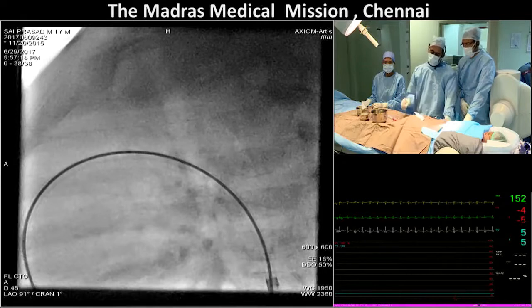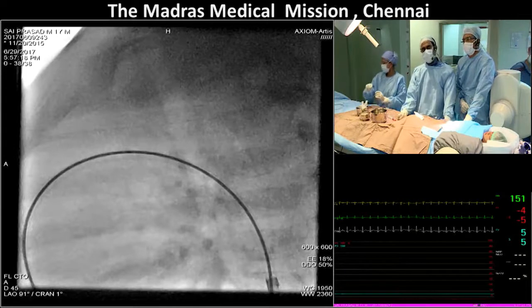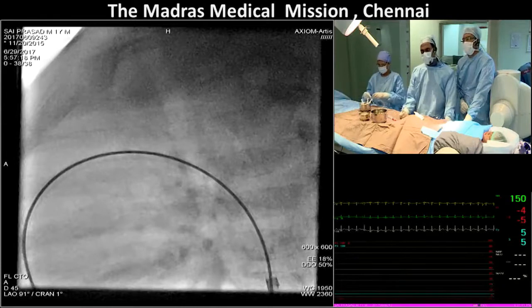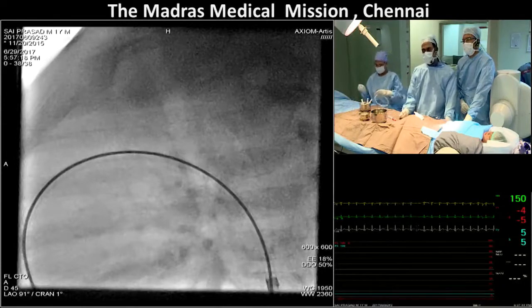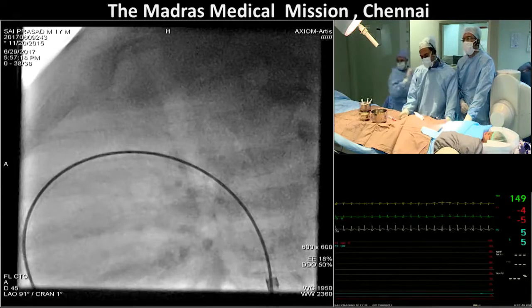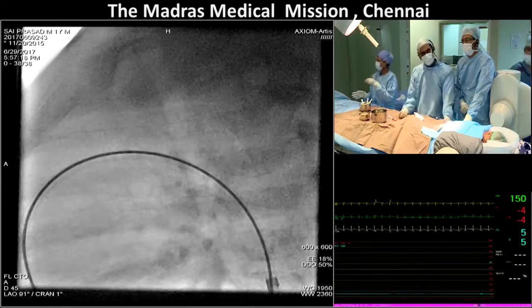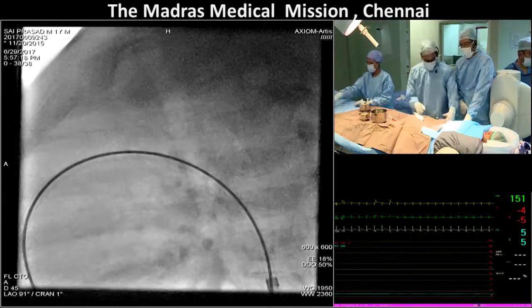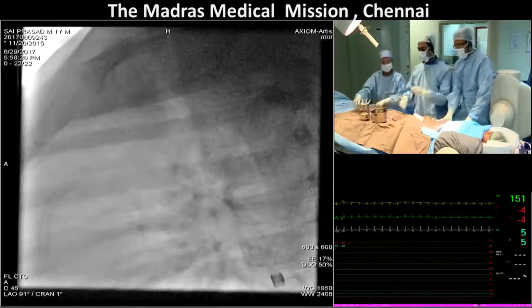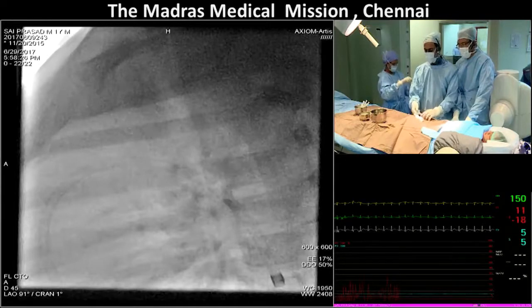Yeah, we have seen spasm, but very often the size of the device we will be deciding based on our echocardiographic dimension. So in the rare event the PDA is looking very small in the angiography, we will still go by our echocardiographic measurements in a smaller child. But of course, the situation will differ in an adult who doesn't have a good echocardiographic window. In a small child of 1 to 1.5 years, when we have reasonably good pictures, we tend to believe the echocardiogram a lot and do the size assessment primarily on echocardiography.